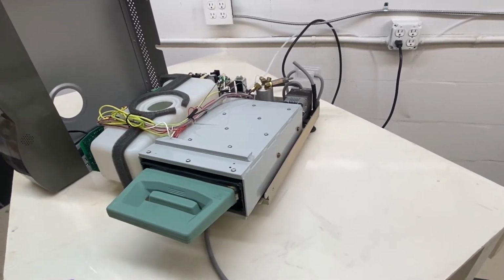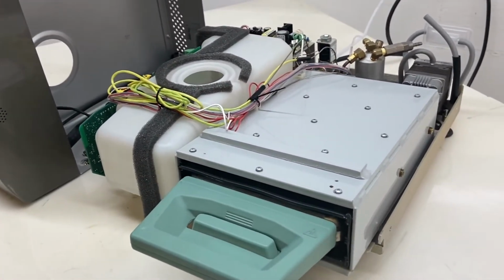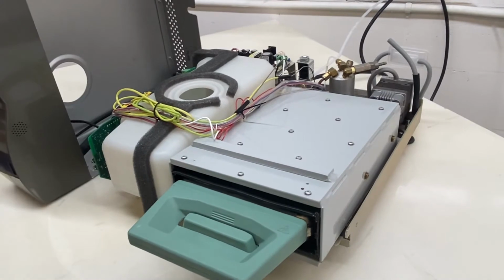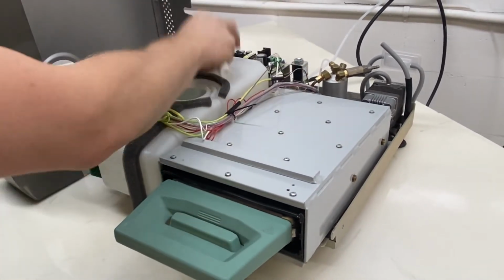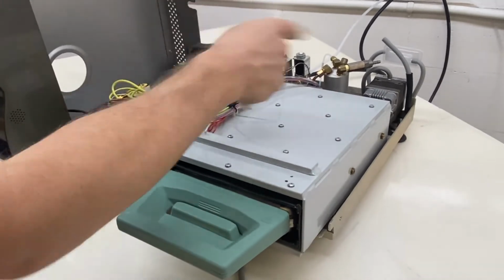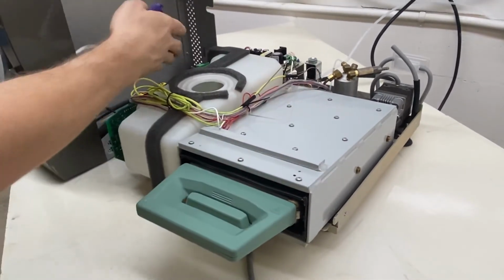Possibly also, one last thing, is that you could have constant power to the boiler. That could be tested also if you give us a shout. You're going to need a voltmeter for that. But basically what that does is that sends volts to your boiler constantly. So the boiler's getting volts, and then your water pump is pumping and pumping and pumping, and it never stops and it keeps going. If that's happening, then it's a board issue.